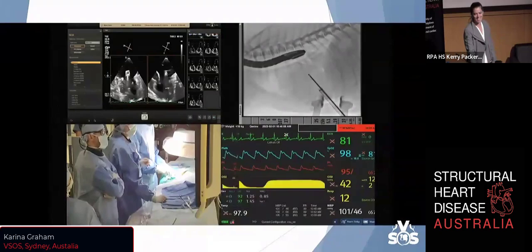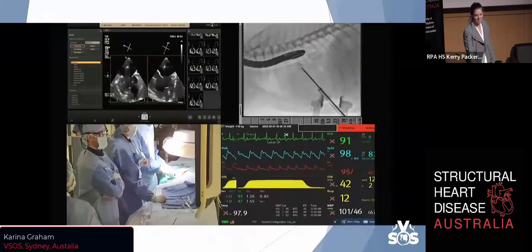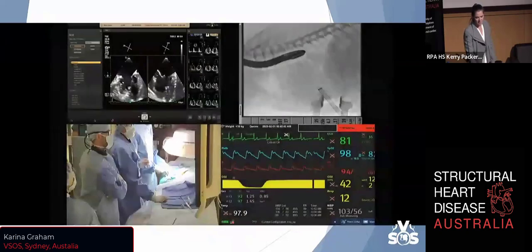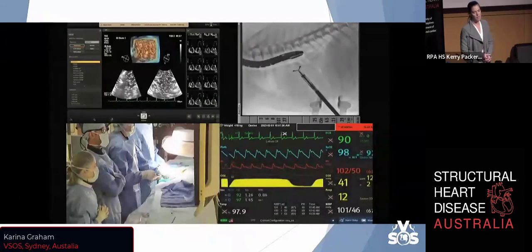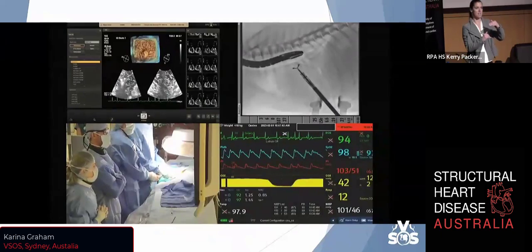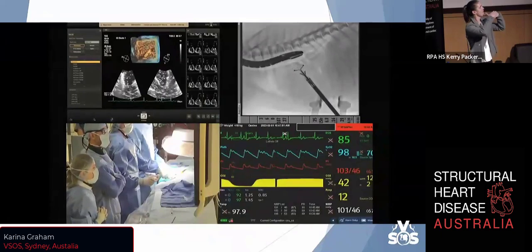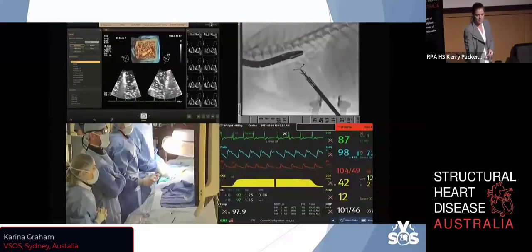You can see the TOE guidance, the fluoro guidance, and then we're going to advance that sheath up over the valve. What's interesting is the nice part of when you actually reduce the mitral regurgitation is the heart rate seems to go down quite nicely. And so the actual device, it's got those 2 arms, the top arm, the bottom arm. We open the device up into the LA, and then we're essentially going to nuzzle it down. And so the bottom arms end up below the mitral valve. We then put some pressure up to capture the valve. We do a soft clamp, which is when they start to touch each other, and then a hard clamp, which is where they tether it up, and then we release if we're happy.